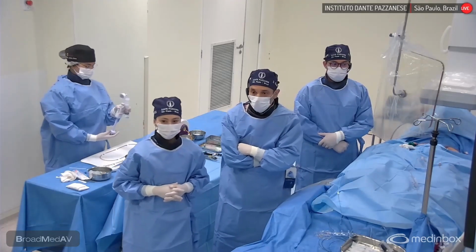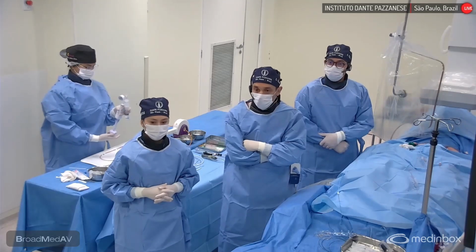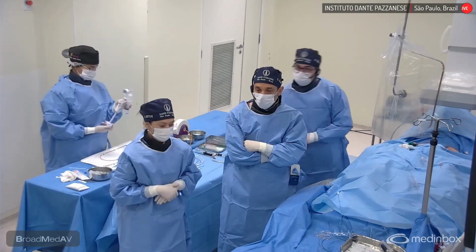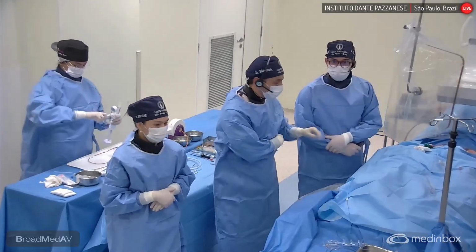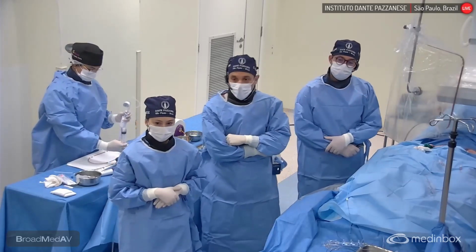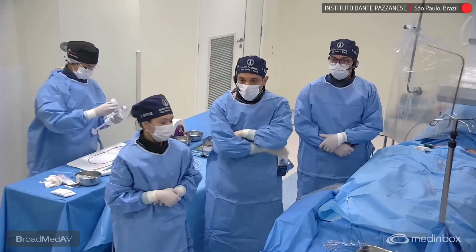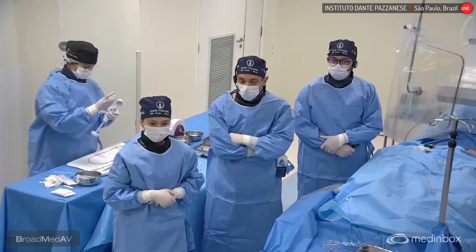My name is Dimitri Siqueira, and I'm proud to be here with my colleagues to show you the first case for today. Here on my left, Alberto Servoni, who's going to be the first operator of this case, and Michele Birchi, our fellow in structural heart disease intervention.